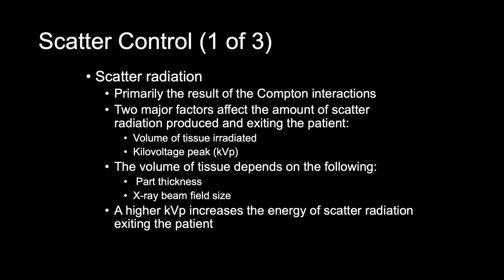So we want to get rid of the scatter that fogs the image, but we also want to reduce the patient's radiation exposure. The probability of Compton scattering does not depend on the atomic number of the atoms involved. Compton scattering may occur in both soft tissue and bone.